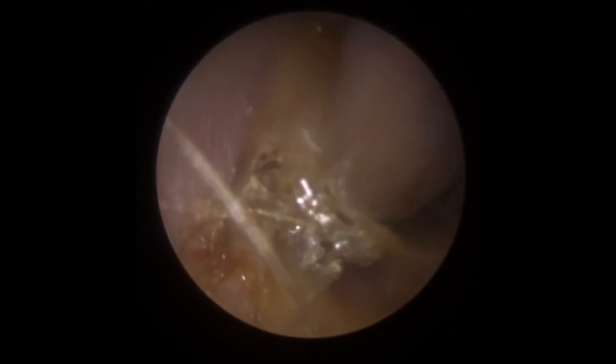We can see as we peel away from the side just how much of that dry skin is there. I've had a brain wave — if this dry skin is sitting just in front of that piece of wax so we can't pull it away directly, if we can hold on to this bit of skin and pull it, I'm hoping it'll lever this bit of wax out to that corner. So crocodile forceps are going to come into play now and we're going to get a grip on this little bit of skin.